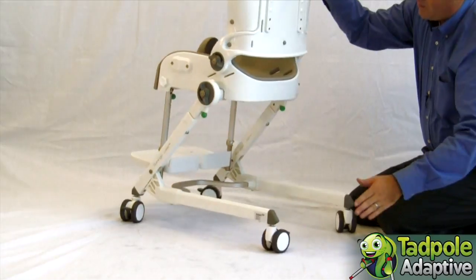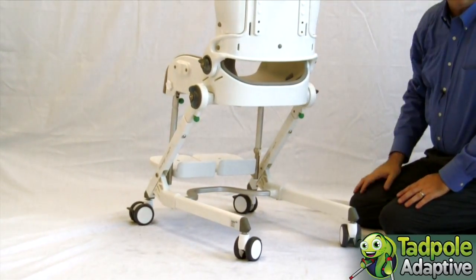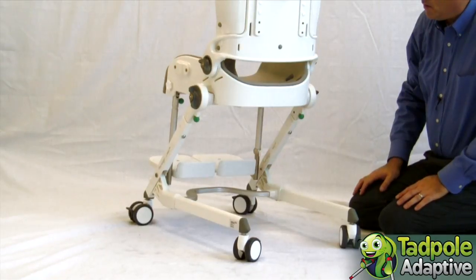The Flamingo also has an accessory pan so it can serve as a bedside commode or a rolling commode as needed.